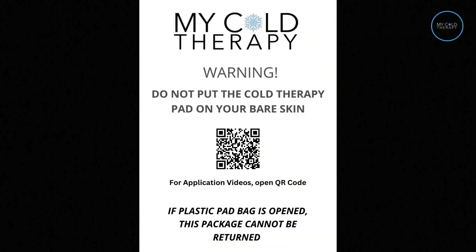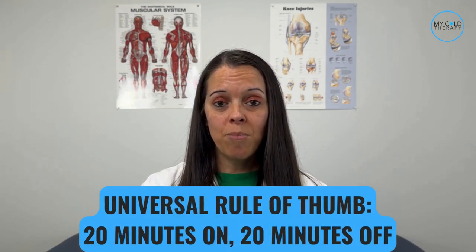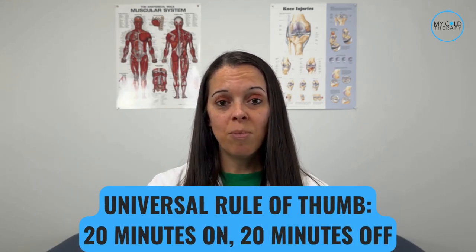The other item you're going to get is a skin warning flyer. You never want to put the cold pad directly on your skin, as it could cause some damage or frostbite. The universal protocol for cold therapy is 20 minutes on, 20 minutes off. Please make sure to check with your doctor for any other instructions while using the cold therapy device, just to be on the safe side.